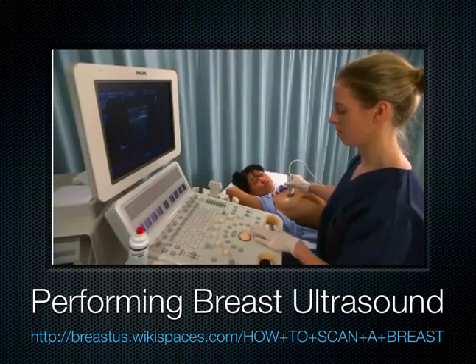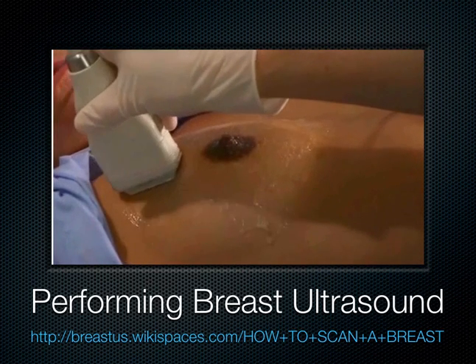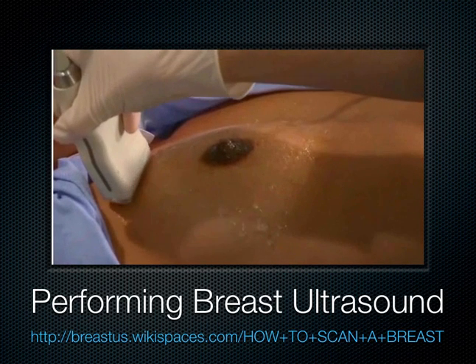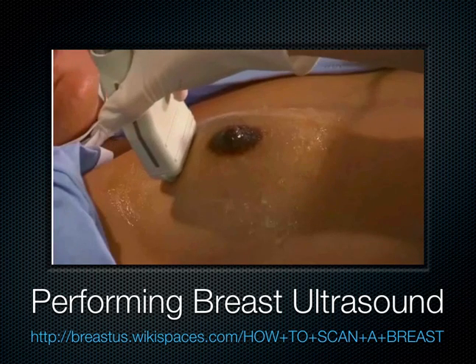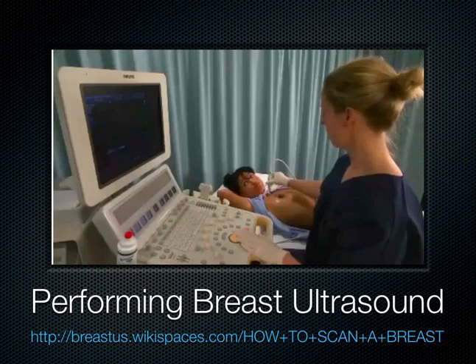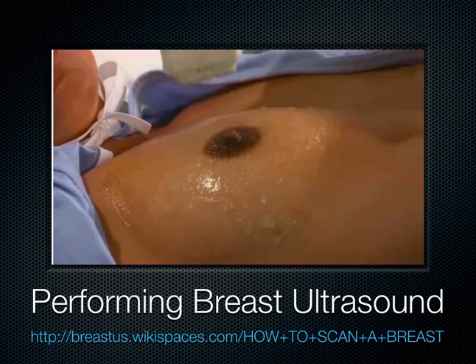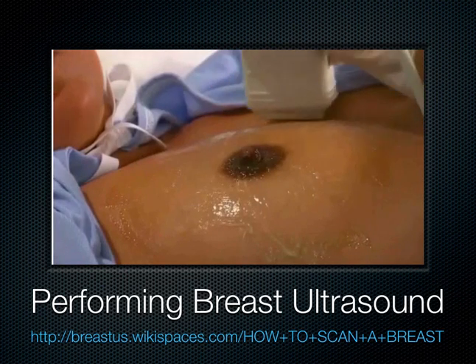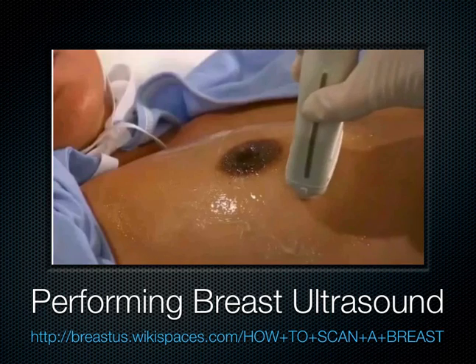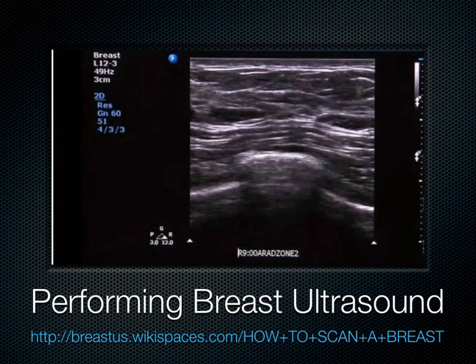After completing the radial scan, return the transducer to the 12 o'clock position at the outer margin of the breast. Rotate the transducer to the antiradial plane. Slide the transducer from the outer margin of the breast towards the nipple. Repeat this at each of the clock positions, moving in a clockwise direction. At the clock face positions 12, 3, 6, and 9, freeze, annotate, and save a suitable image from the mid portion of the breast.